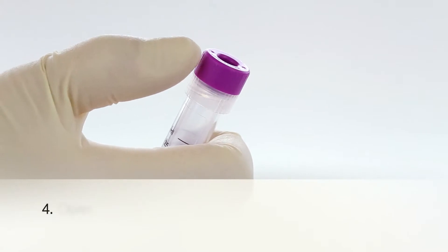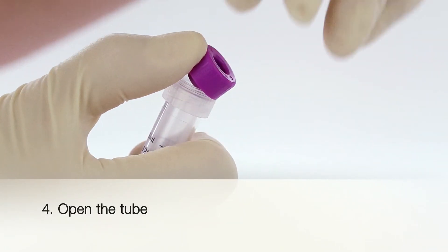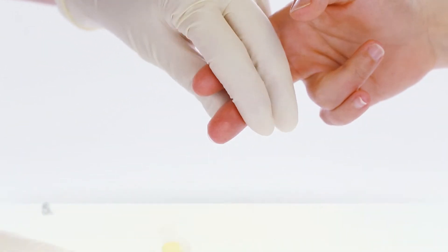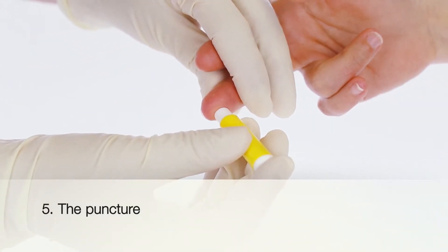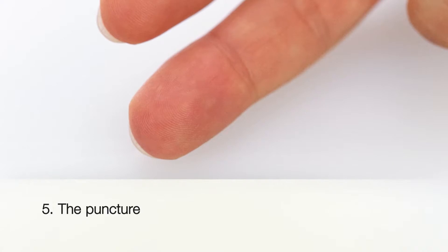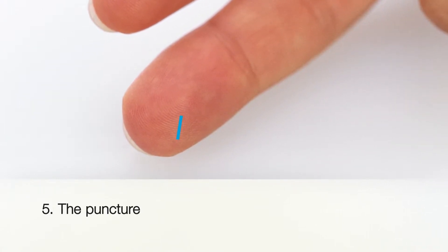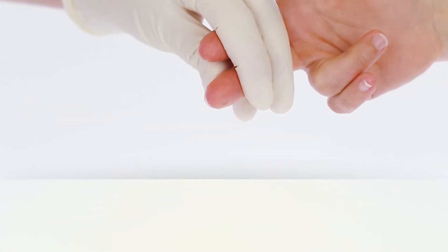The tube cap opens upwards when you press on the ribbed area on the tube. Perform the puncture with a suitable lancet. Position the lancet so that the cut crosses the friction ridges. This technique provides the greatest sample yield.